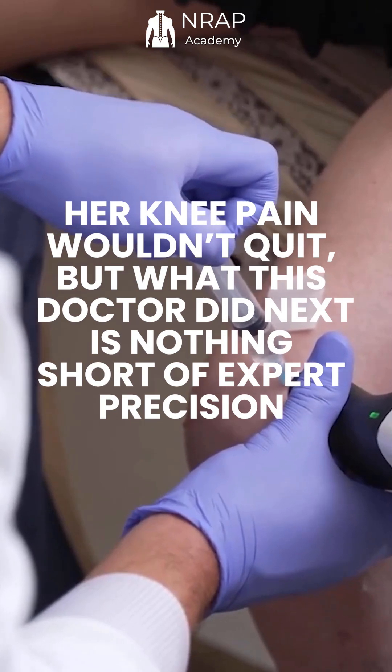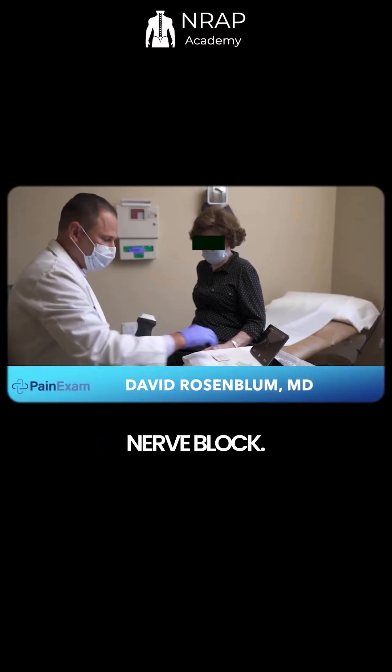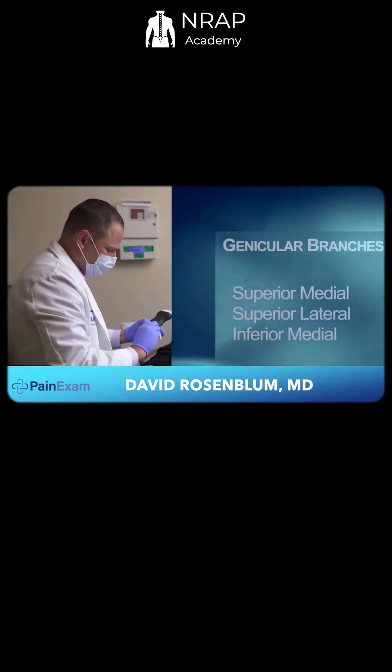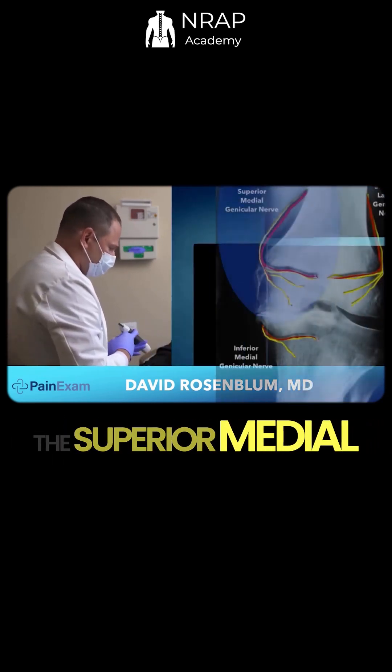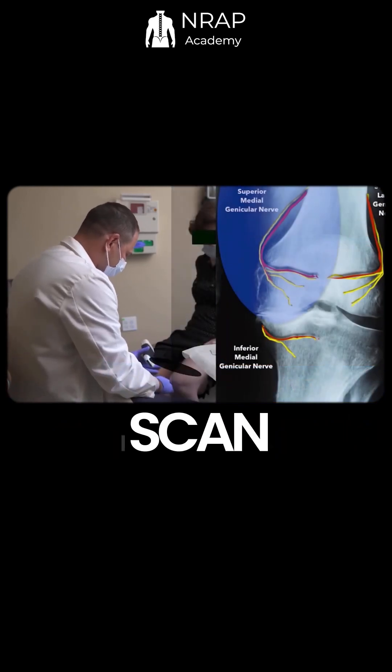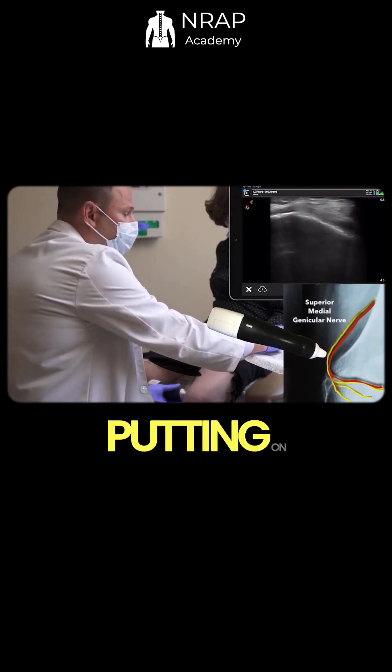Her knee pain wouldn't quit, but what this doctor did next is nothing short of expert precision. We're going to do a genicular nerve block. There are three branches: the superior medial, superior lateral, and inferior medial branch. Looking for the superior medial genicular nerve, I scan the medial side of the knee, putting on color Doppler.